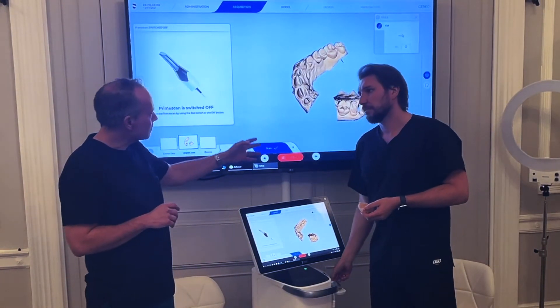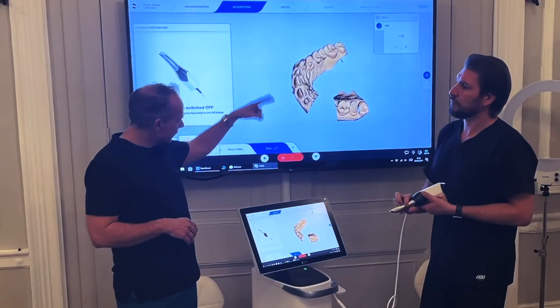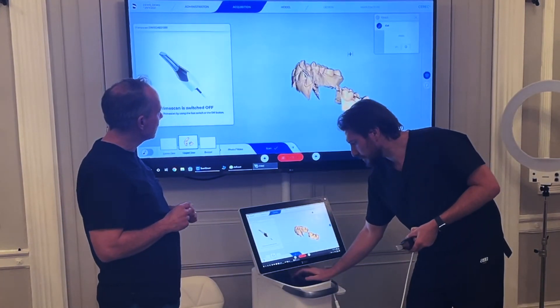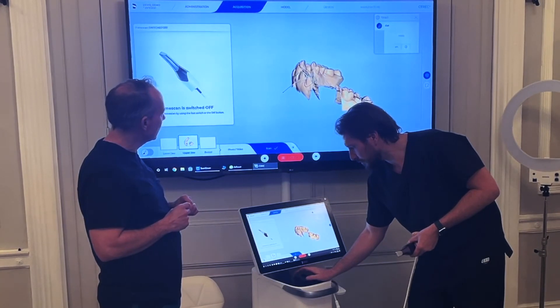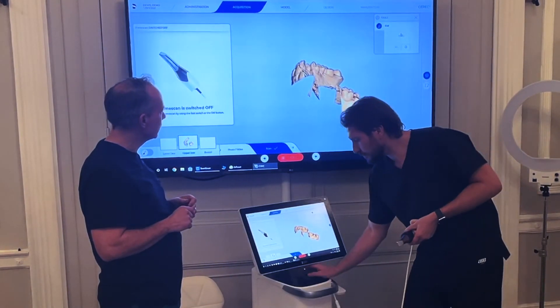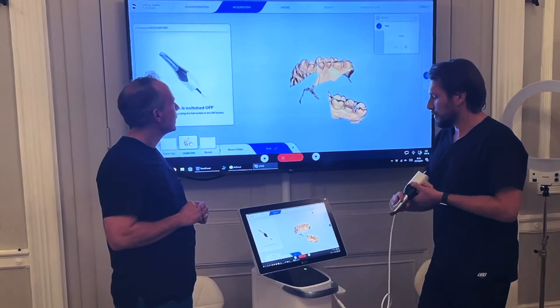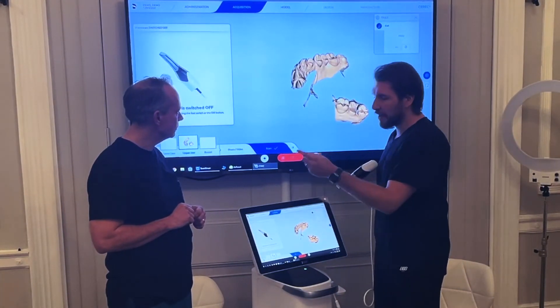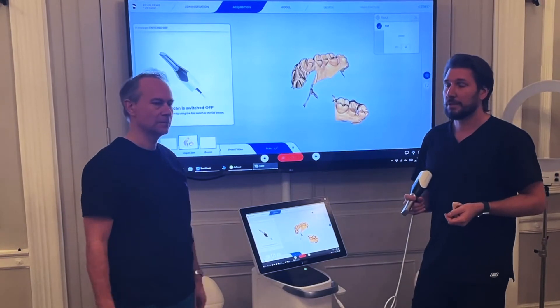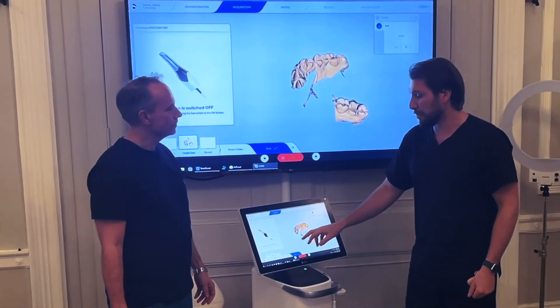Keep in mind that cutting is basically taking a shotgun to your model — it takes that section away. If your model was tilted and you made that cut, you'd actually remove data from the other side as well. The beautiful thing is you can delete a large section, scan back to what's still there, and rescan the rest — it will merge it back in.